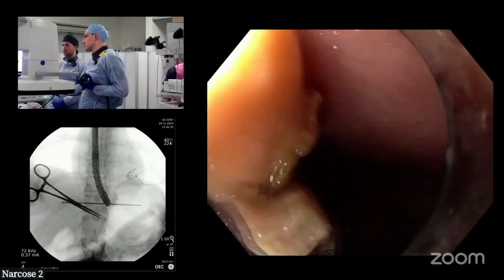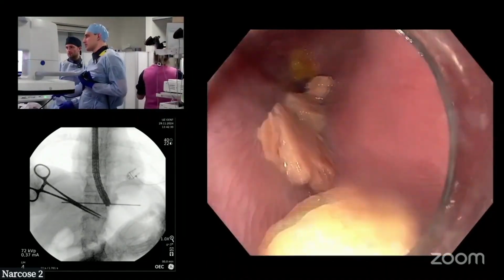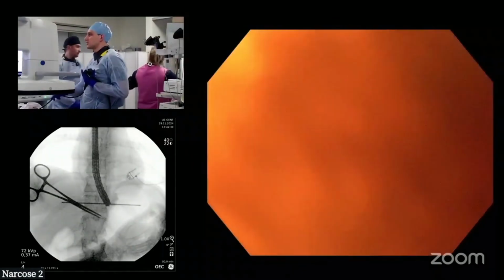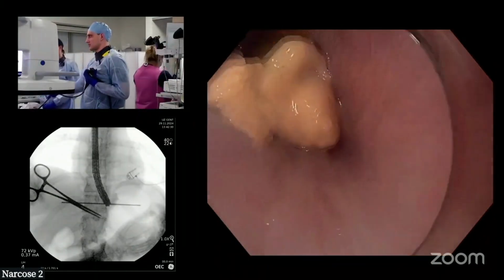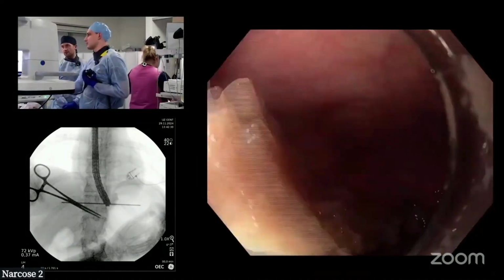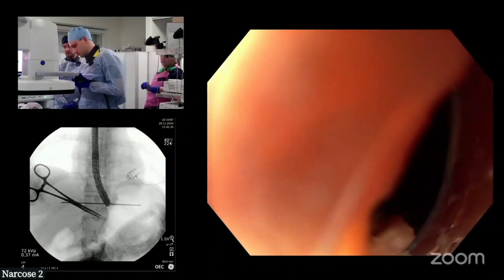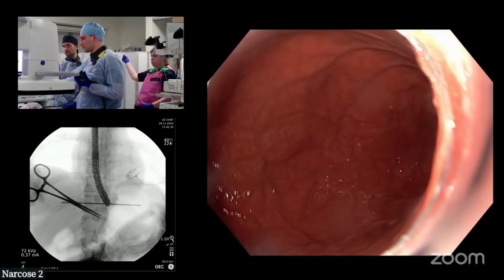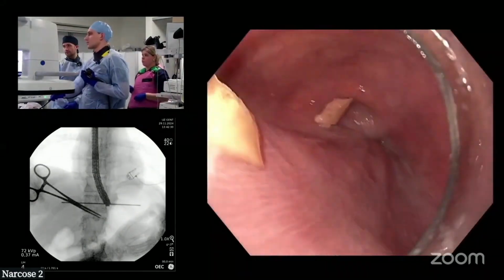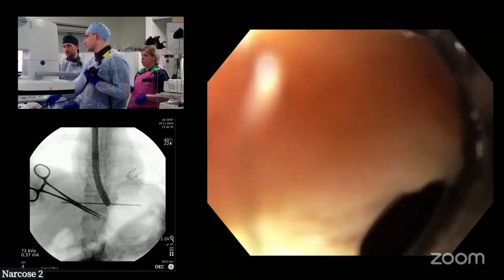Now remove the food. Yeah. Now I would also desufflate the stomach. Yeah, and we need to put a wire, I think. So this wire is quite a Savary wire. Yeah, Savary wire. It's very, very traumatic. You must bear that in mind when we're placing it. As in, don't just do what you do with another wire, which is suck that out. Just take the scope out. Yeah, all right, do that. These pieces are probably okay. It's actually air and food.